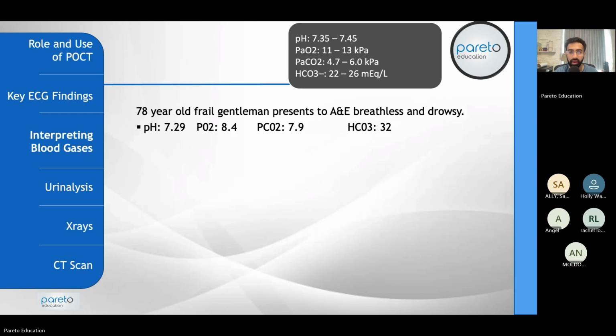Metabolic. So we say metabolic acidosis. No, people are still typing. So I would look at this ABG and I could clearly see that the pH is low. So there is some form of acidosis. The oxygen is also low. Oh, right. Okay. I can see the answers now. Respiratory acidosis with partial metabolic compensation.